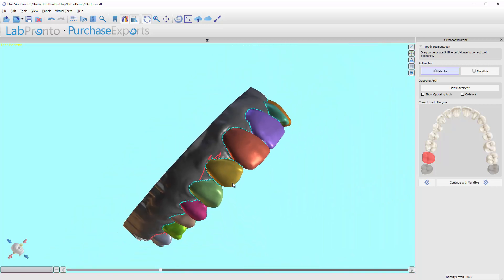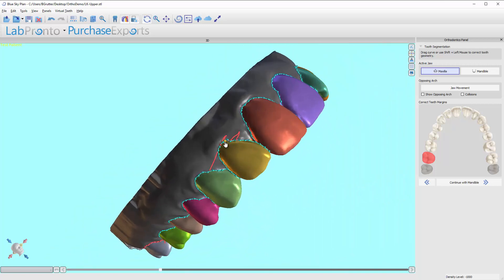I would hit Control Z to undo. The reason this happened is notice this is still blue or teal — this one back here is red. This is the active tooth. I tried to adjust the margin up here when in fact this was the tooth that was active. It tried to ring the line all the way up here. I can just hit the undo button right here or use the keyboard shortcut, Control Z.